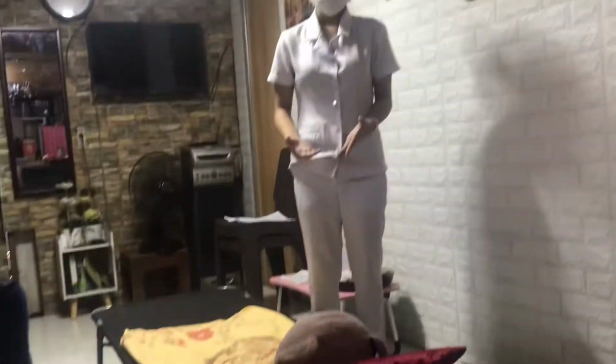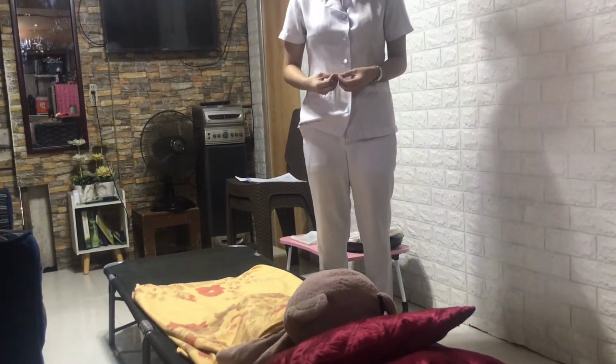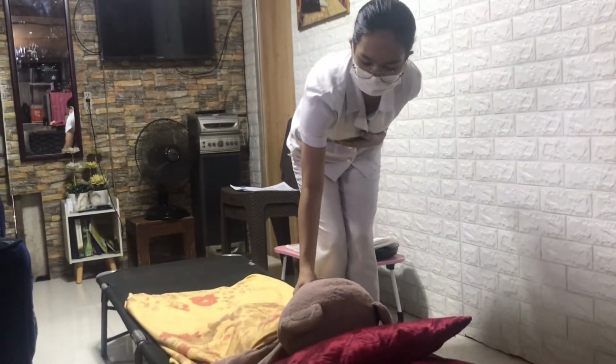But before anything else, ma'am, may I have your name and your birthday, please? Karen Kate C. Gabriel. Thank you for that. And may I check first your wristband? That's great. By the way, ma'am, for this assessment, we're going to insert the catheter in your genital area. Let me know if you are good with that.